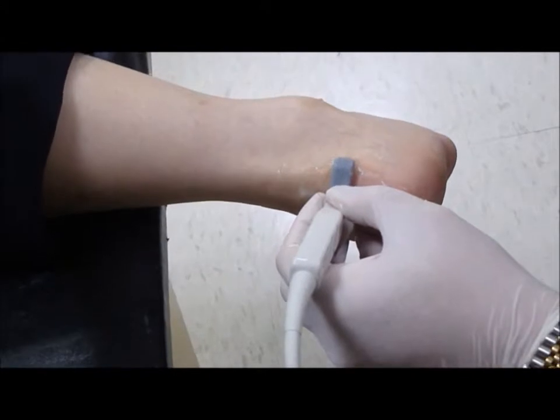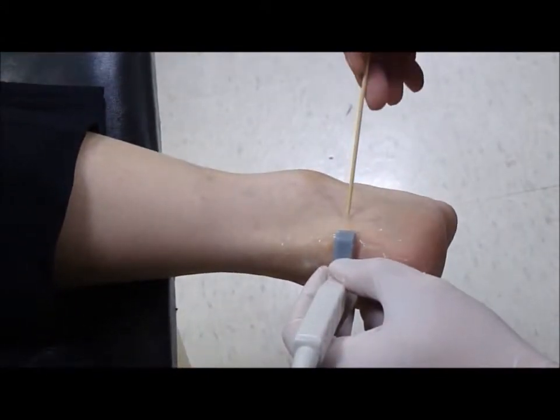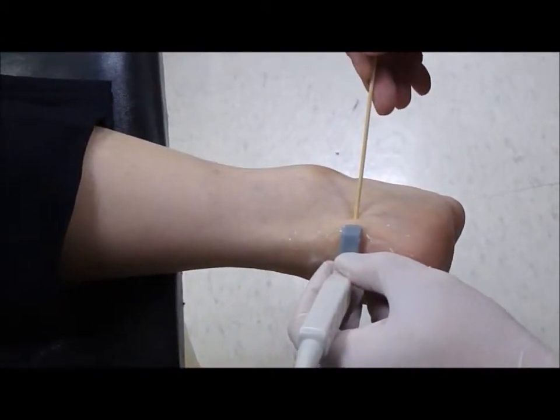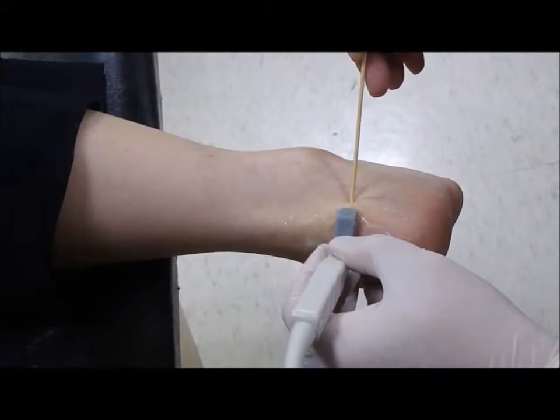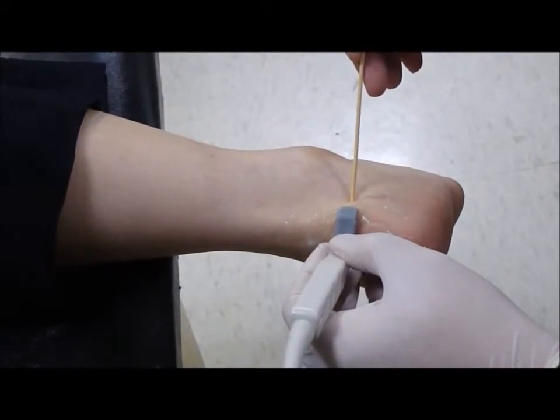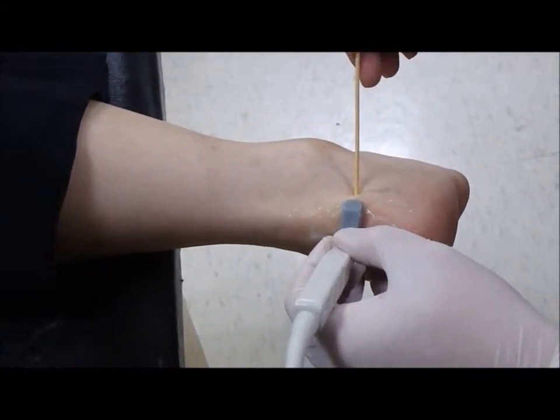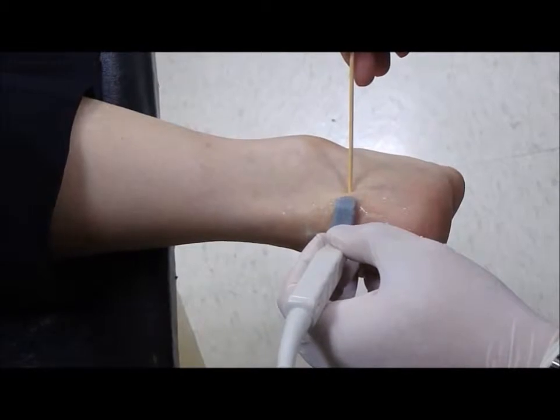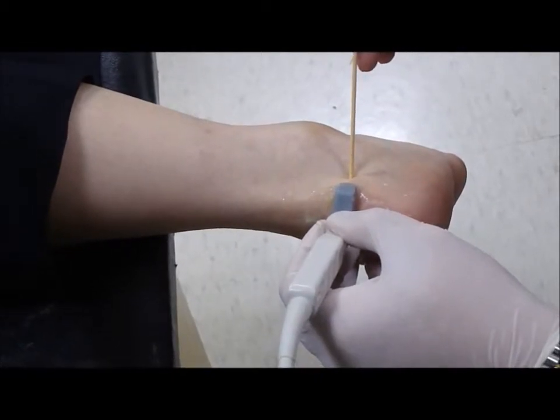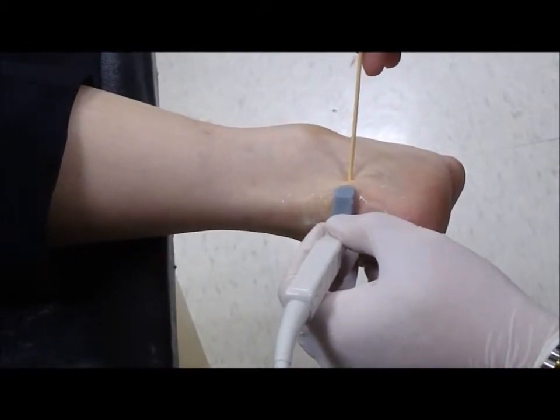It is under this sonographic view in which the needle is guided into the bursa for the injection treatment of retrocalcuneal bursitis.